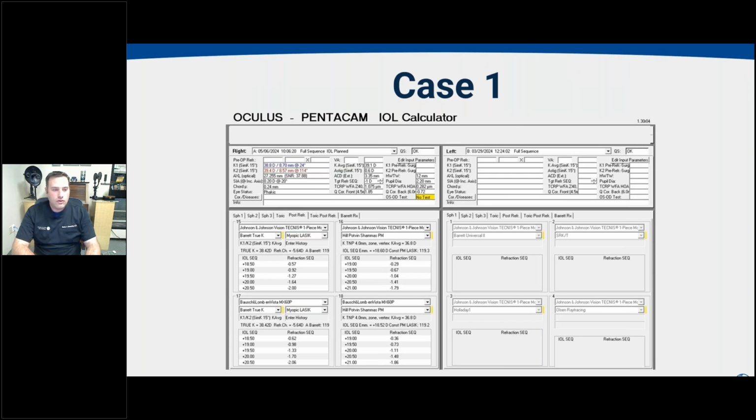And one of the really convenient things I do find with the IOL calculator is the tabs that you can see right above the IOL calculations. With those tabs, it makes it nice and easy to click through to what you're looking for in your IOL calculation. So it gives you 3 preset spherical options, which you can customize in any way, and you can change on the spot, so you don't have to use your pre-customization. You can either choose to use a spherical calculation for one type of lens with multiple formulas, and then have 3 different lenses in sphere 1, 2, and 3. You could use multiple lenses with 1 formula and have 3 formulas in 1, 2, and 3. But it really limits the amount of clicking you need if you have some go-to, particularly monofocal or even spherical multifocal lenses, that you use on a regular basis without having to do a lot of clicking or changing.